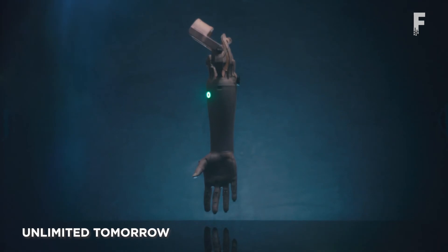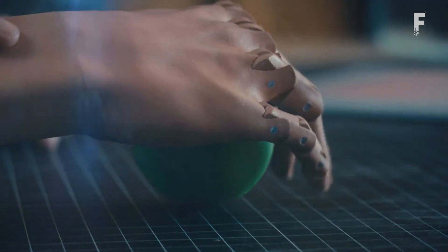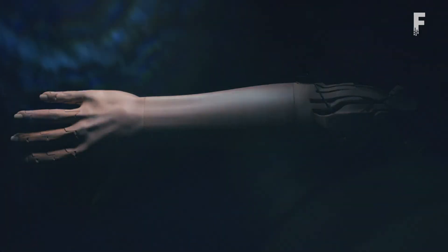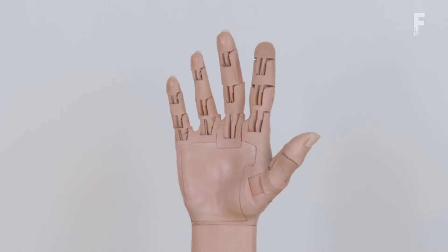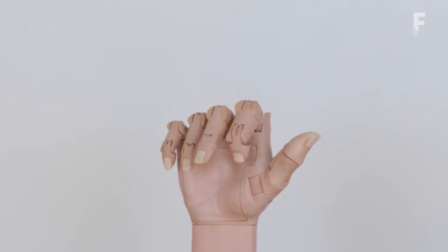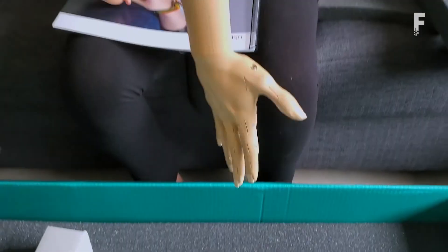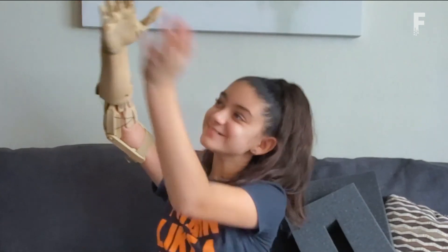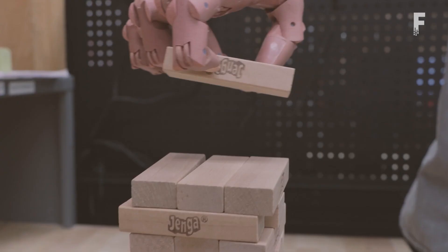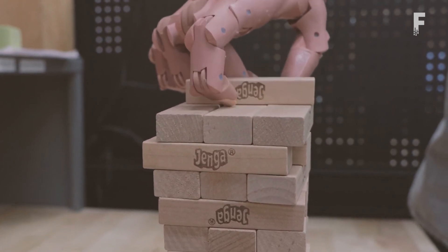Unlimited Tomorrow is a 3D-printed robotic arm that's extremely functional and affordable. They are powered by standard hobby servos that actuate each finger and include an optional wrist movement. Each joint is equipped with a small elastic band, making each joint independent and able to grasp objects with ease. Candidates scan their limbs using a 3D scanner at home with the help of a friend or family member. A traditional device can cost up to $80,000, while TrueLimb costs $8,000, largely because there's no middleman involved.